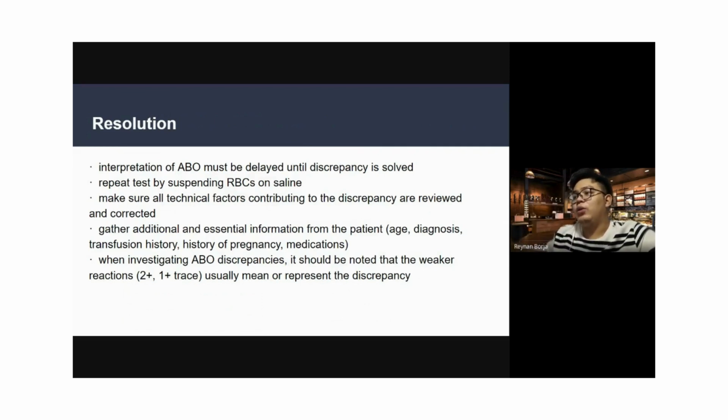Next is clotting. What if during extraction, si MEDTECH nahirapan, nagka-hemoconcentrate, nag-clot? Possible din po. Next, nag-dry up na. So, possible nangyayari si dry up kapag slide method. That's why we don't recommend slide method as the routine test method for blood typing. Okay? Next is reading microscopically after prolonged sensitivity. So, yeah.